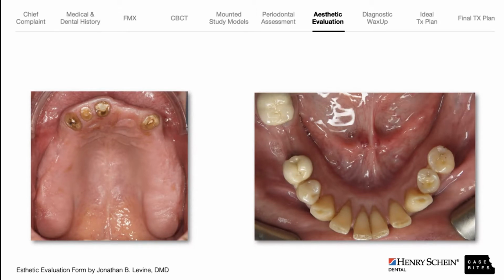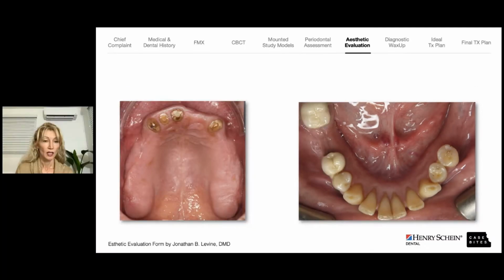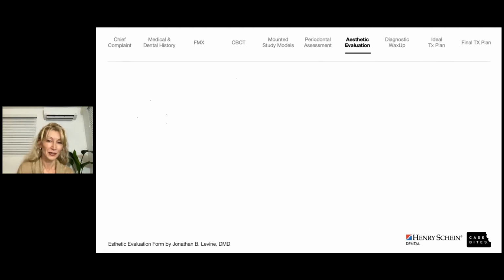and we attempted some orthodontics through both conventional orthodontics with braces and Invisalign, and patient could not tolerate it. So we had to abort that option. In any case, we can see that the patient has no posterior support, so a lot of issues to address here. But just like with any other case, we like to have a few steps that are very critical.